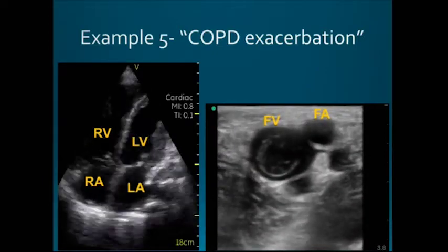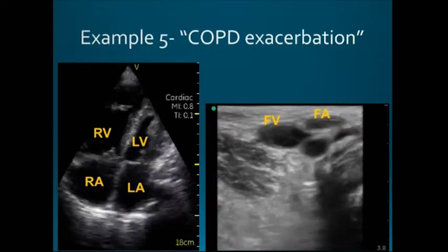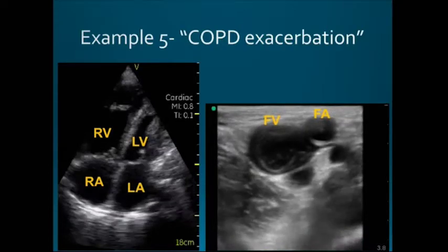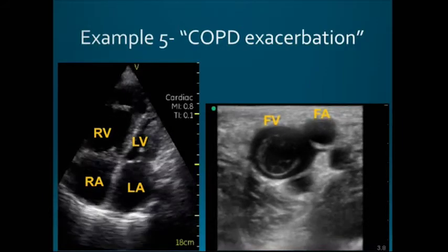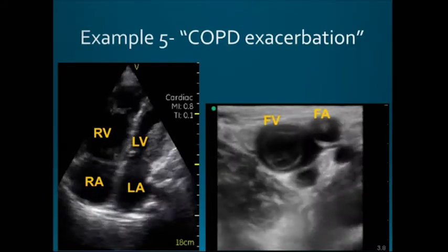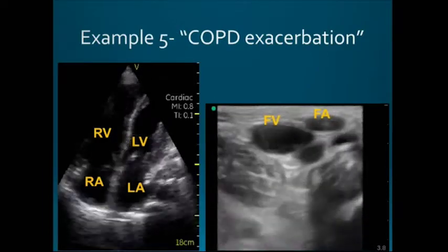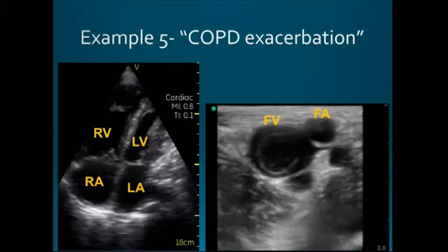So in a person who has acute right-sided dilation, it makes you think of pulmonary embolism. And then we took a look down at his legs here. This is his femoral vein, this is femoral artery, and you can again see that he's got a thrombus just sort of sitting there. So he has a presumptive diagnosis of PE at this point. But he was too unstable to go to the CAT scan, so we treated him with lytic therapy purely based on these images. And he actually did very well.